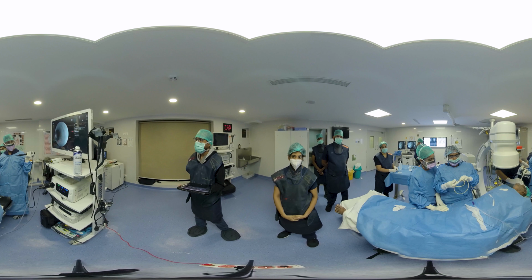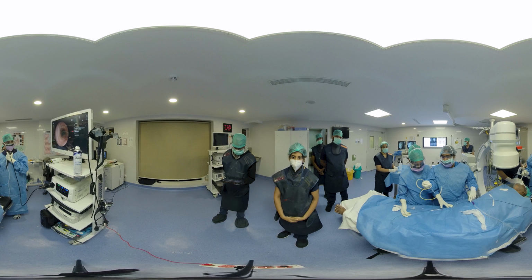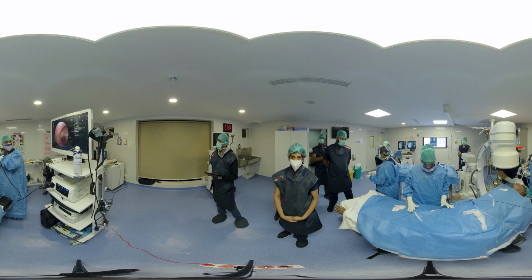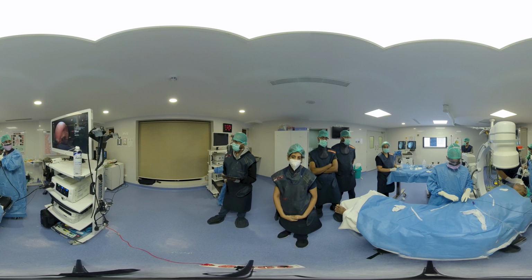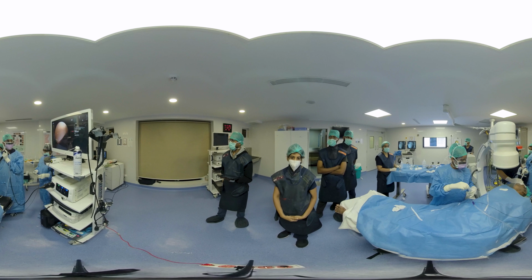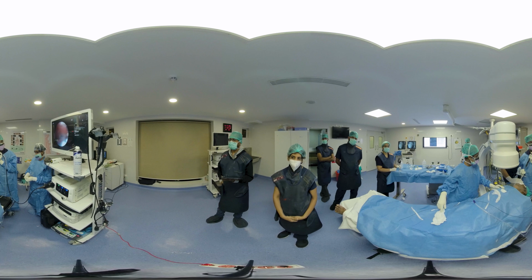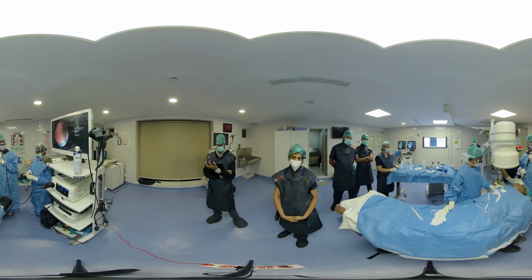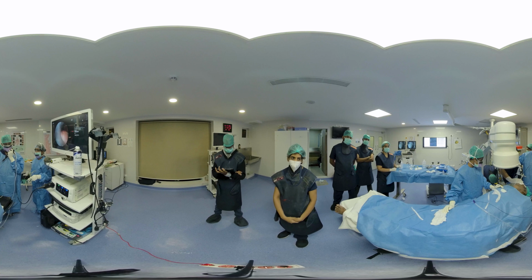After intubating the patient with the rigid, now we are passing the thin scope, and we are visualizing the airway. As you can see from here, the airway looks good. There are some thick mucoid secretions in the upper lobe, which we are removing. And now I am going to the left main bronchus, aspirating the secretions there.